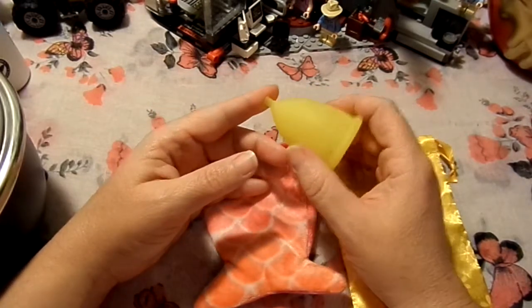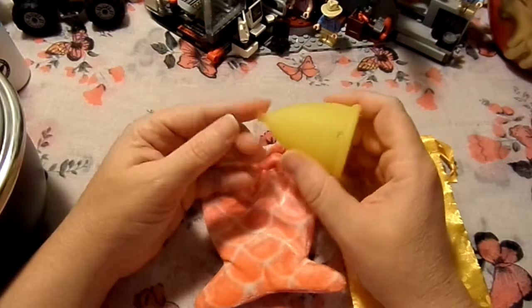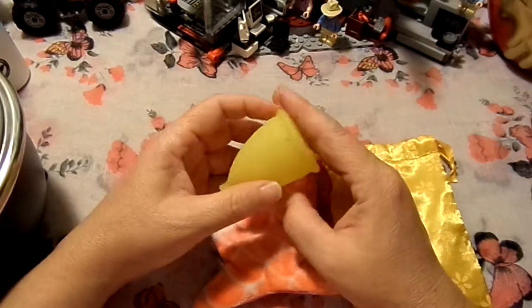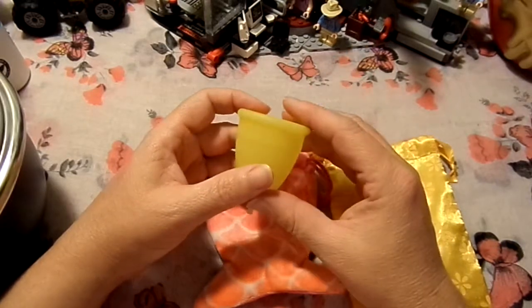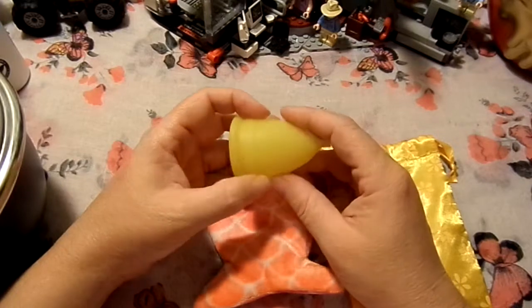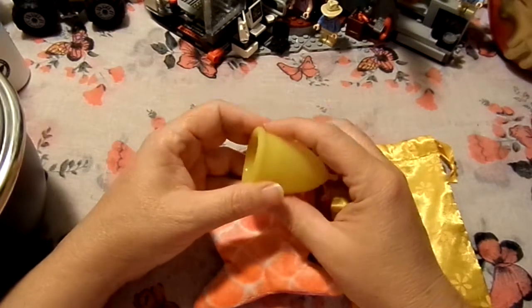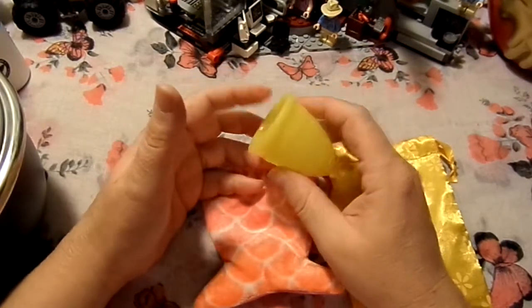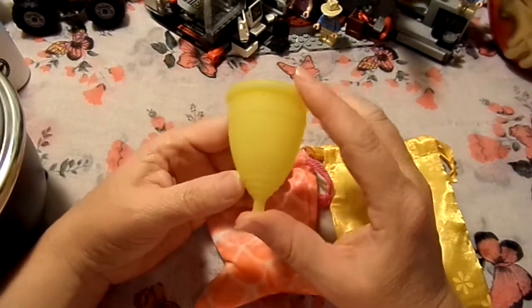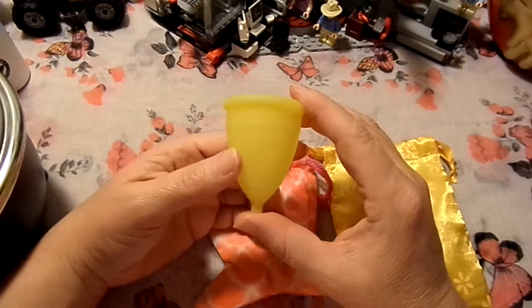the height of your cervix. The height of your cervix when you're not on your period, the height of your cervix when you're on your period. It can drop and go down and up during your cycle. So sometimes people might have 2 or 3 cups that will work for them over their cycle, just because their cervix may drop lower or higher. This cup may not work for somebody with a really low cervix.